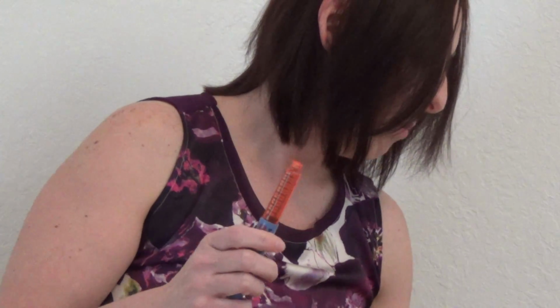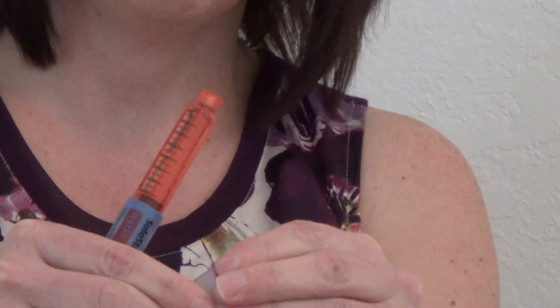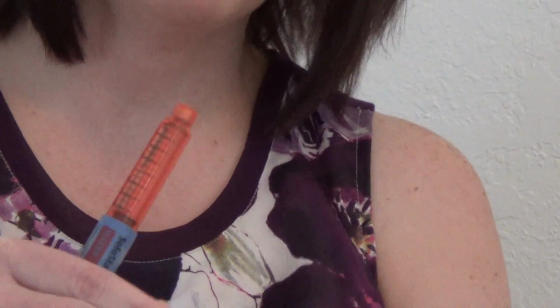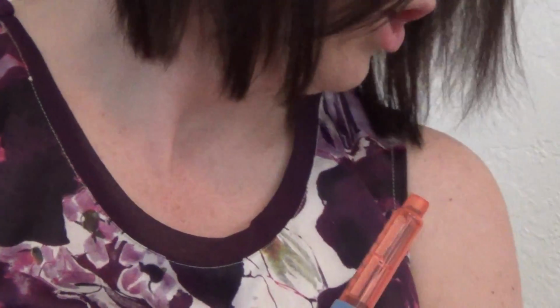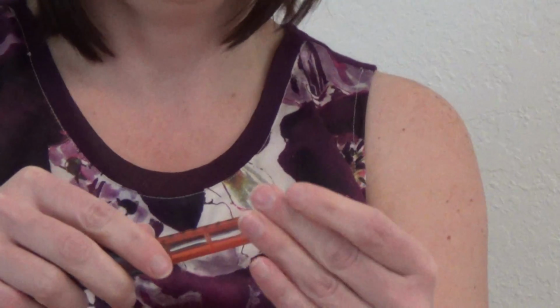You want to remove the cap from the pen and place the pen needle on. Various brands work with this pen. Today I'm using the BD brand. You want to pull off the protective seal and screw the needle on.